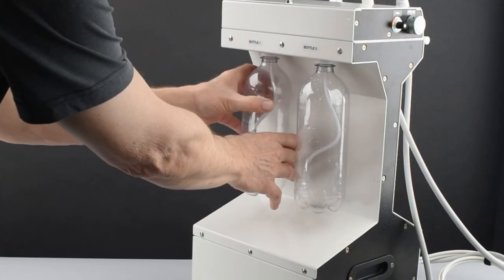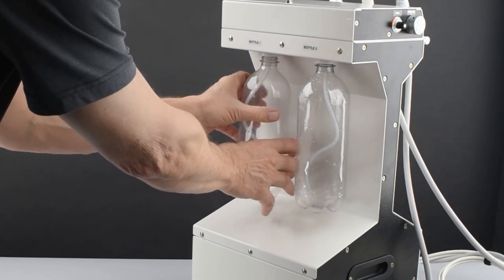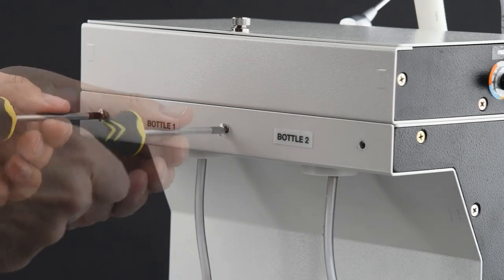Remove the backing plate by first removing the water bottles and then unscrewing the 12 mounting screws located on the back and on each side of the dental unit.